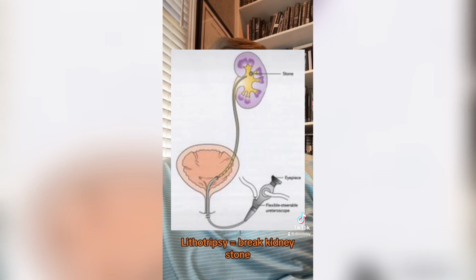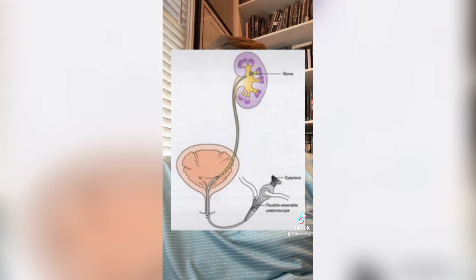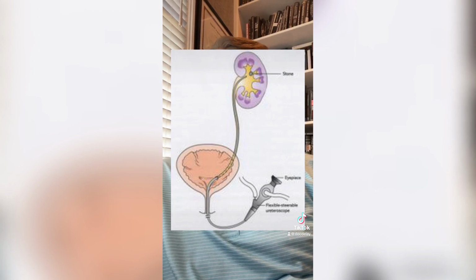For most stones, we're going to do something called laser lithotripsy, meaning using a laser fiber to break up the stone. This is done through a process called ureteroscopy, where you're asleep in the operating room the majority of the time. We run a small scope called a ureteroscope into the ureter and then place a laser through it and use the laser to crack and fragment the stone. We can either then remove the pieces or basically bust the pieces up into such small fragments that they will pass easily.